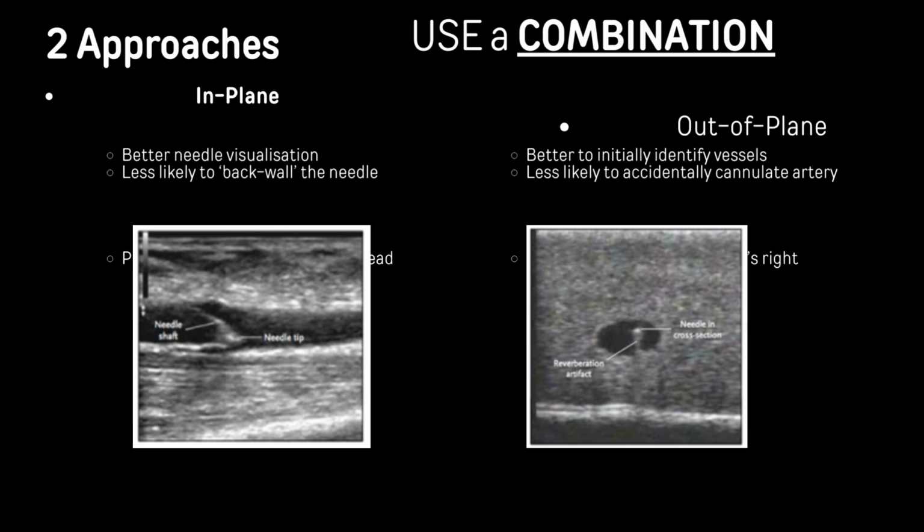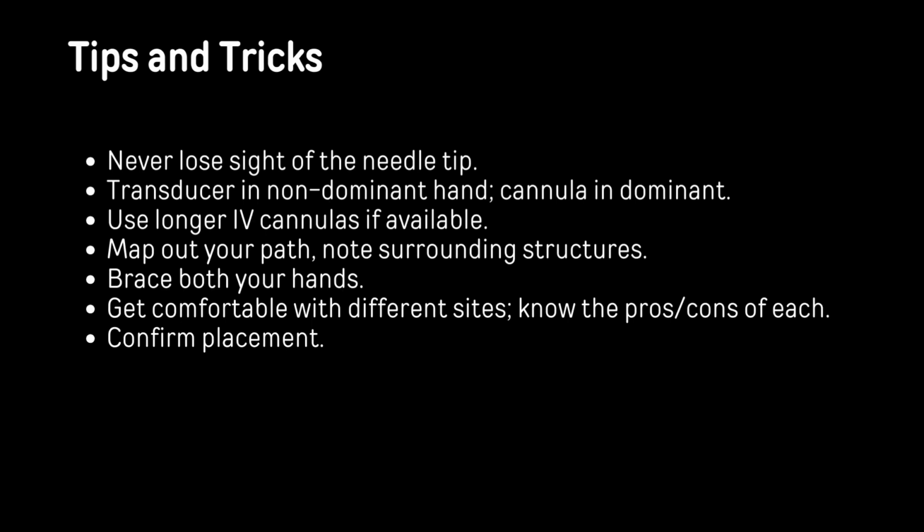But my tips, okay, just figure out where on earth your needle tip is. I see so many people just going past and then the needle's all the way in. And then you don't know when you're in, when you're out, when you hit the lung, especially if you're in the neck. So I think that you should be able to follow your needle tip. Right?